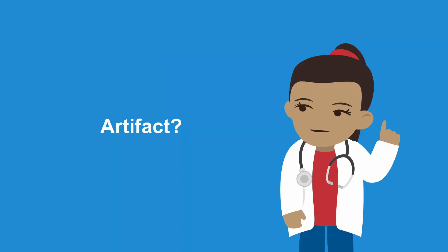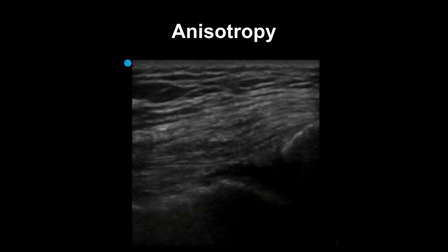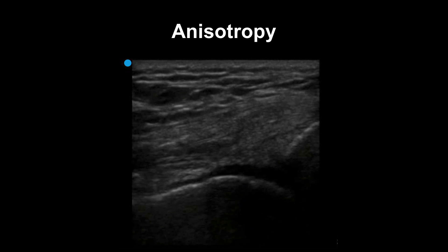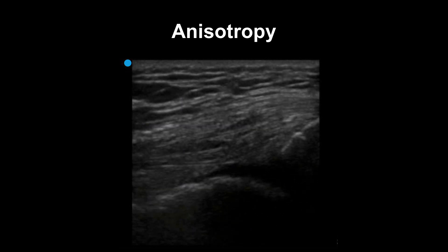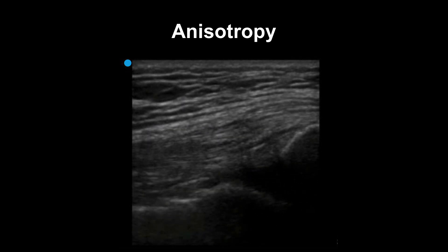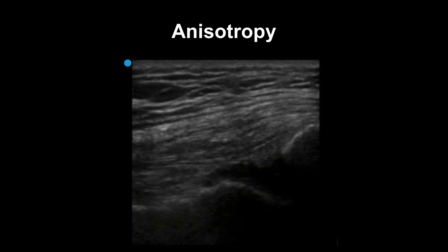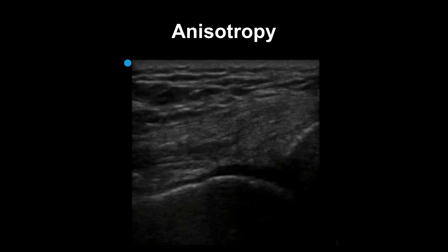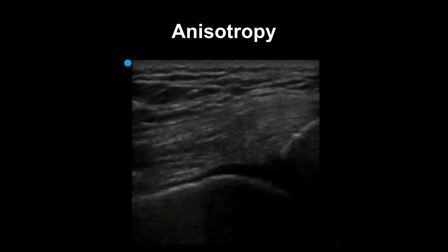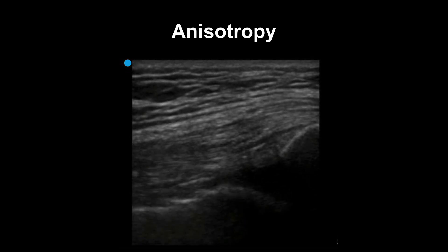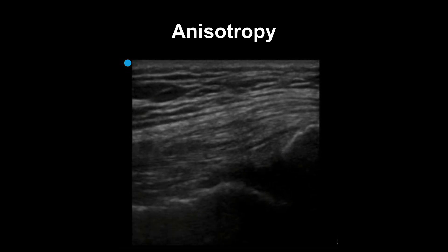There is one main artifact to know of when scanning the knee: anisotropy. This is the large quadricep tendon demonstrating the concept of anisotropy. You can see that as the operator scans through the tendon, it tends to look more dark when the probe is off axis, and then the fibers appear bright again when the probe is directly on axis.